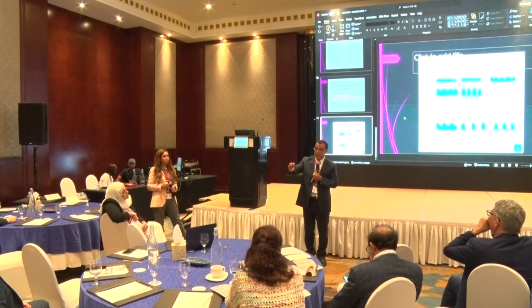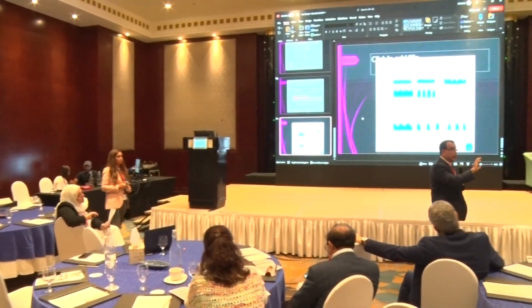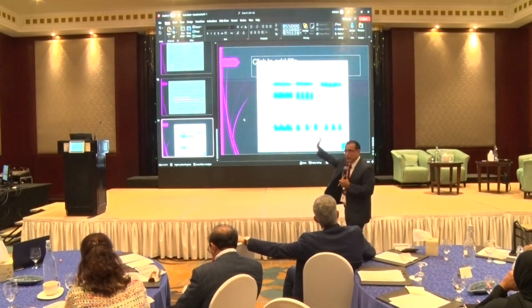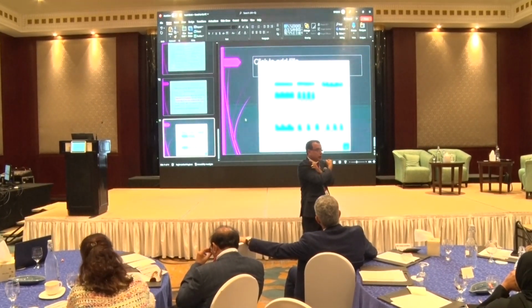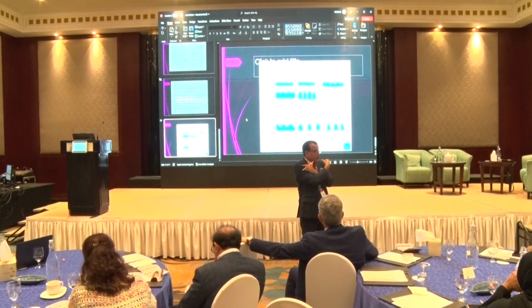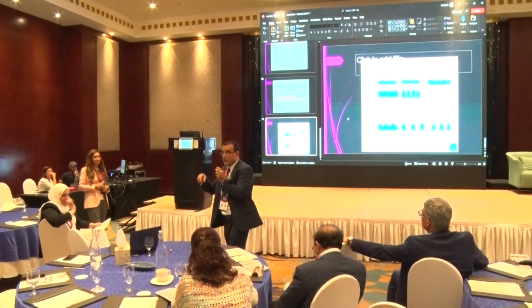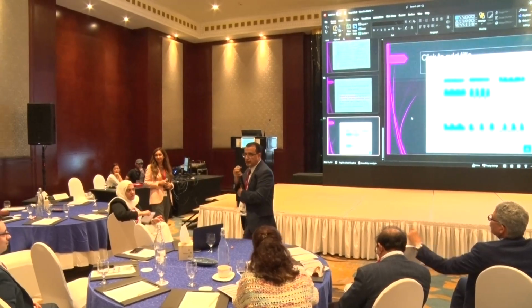Yeah, so the PW of the inflow and outflow at once, both together. You can widen your scale to involve both of them. Yes, aortic and mitral valve, because the other ones are not neighbors. They hate each other. Tricuspid and pulmonary, they do not like each other. It's just like my hand. Remember, this is my hand, the one I told you about. This is the tricuspid valve here, and this is the pulmonary valve right here. So you don't see each other, you don't talk to each other, you don't like each other. But the pulmonary, the mitral valve, and the aorta are very, very close. They hug each other around the clock. Okay.